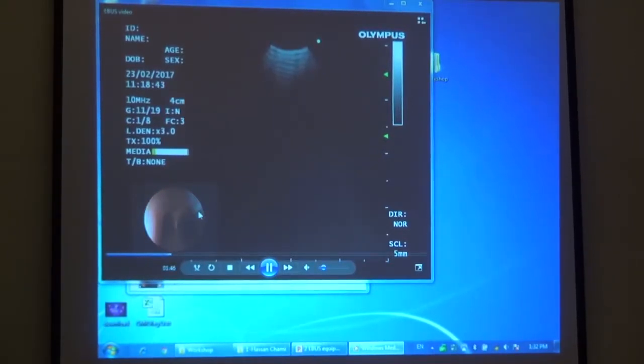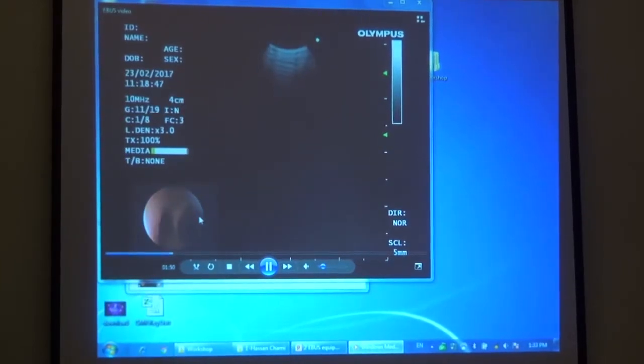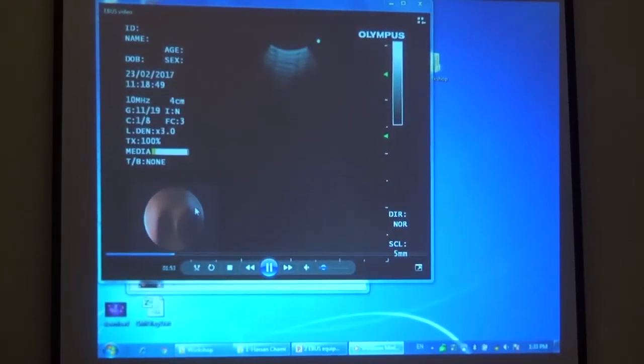If it's out too much, similar to what they said in the video, then you'll be away from the wall. So that's all you need, just to see a small crescent, to guarantee that your needle is not going to push. And here you're against the carina, you're interrogating the carina. I think this is my fellow. He's unable to go. He's trying to go in the left, and he's unable to.